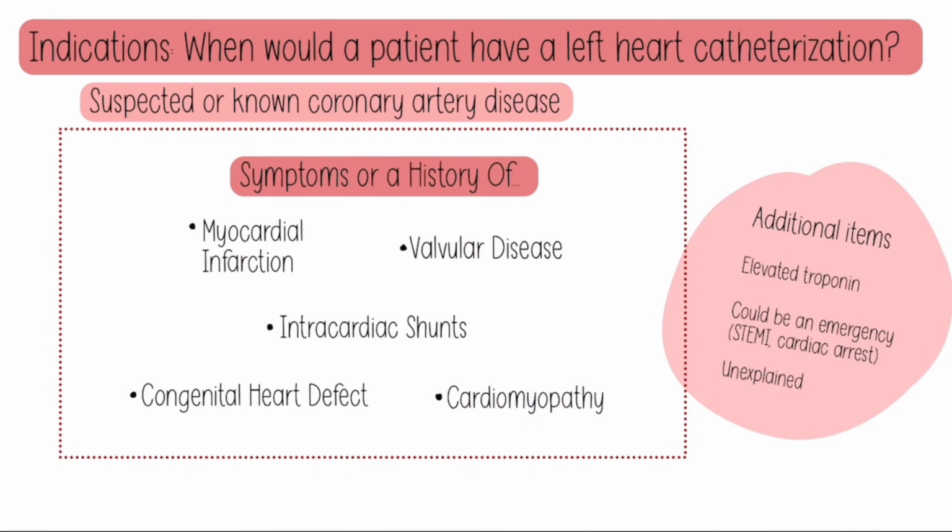So when would a patient have a left heart cath? Obviously, you don't have all of that information before they have any tests done. So you're going to do it when you either suspect that they have coronary artery disease, or I could also say valvular disease, which we'll go over, or if you know they have coronary artery disease.